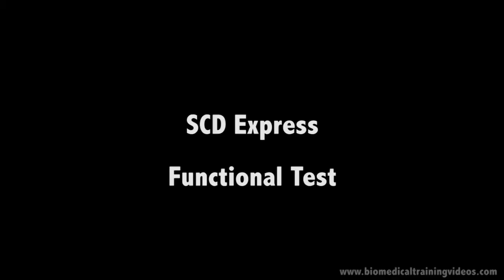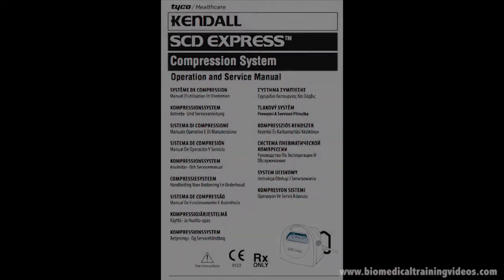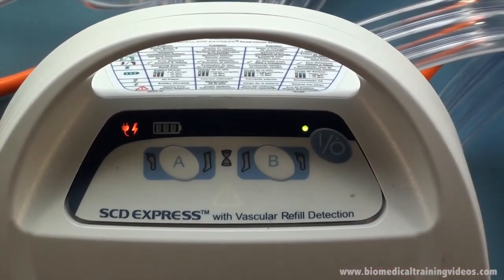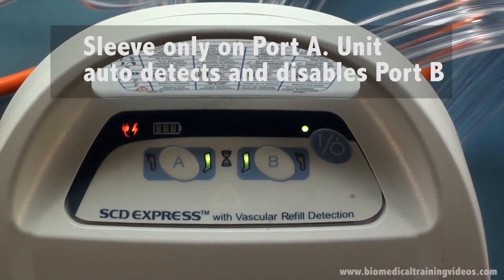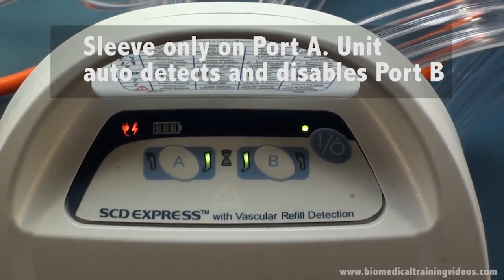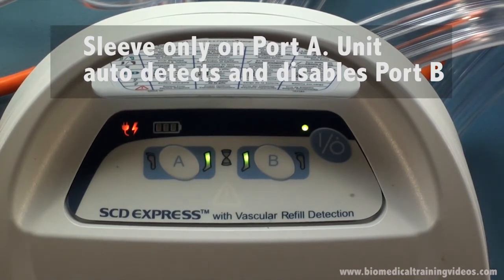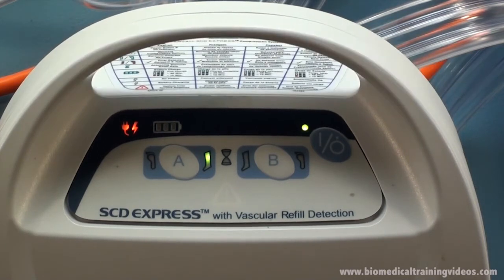Now just go over a functional test and make reference to the operation and service manual. In this first example I have got a sleeve connected only to port A. The unit will auto detect whether there is a sleeve connected and will disable the channel that doesn't have a sleeve. So in this case, B doesn't have a sleeve.